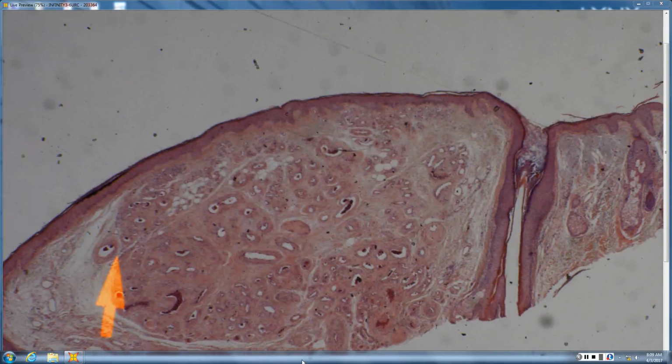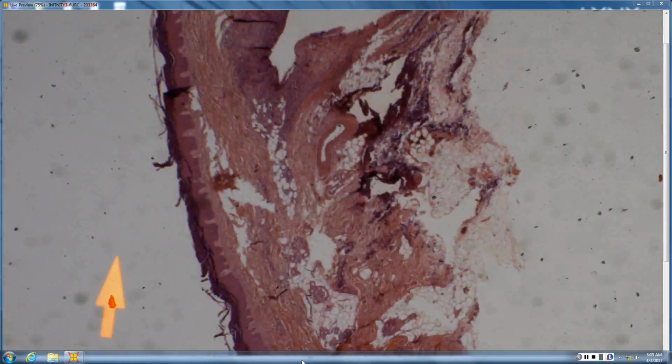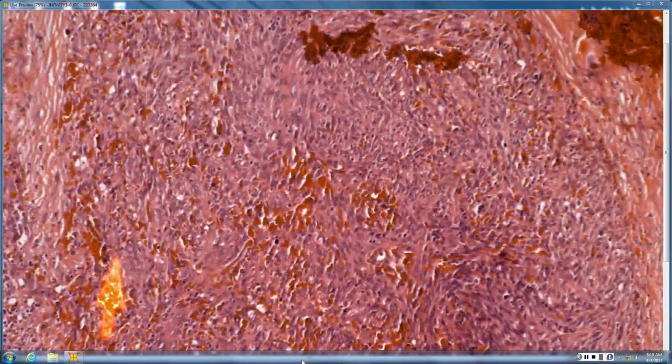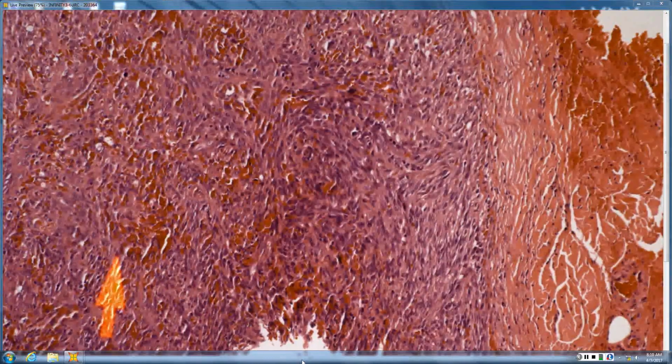So that's sort of the AVM. So thick and thin vessels, so arteriovenous malformation. There's a larger vessel, there are crack-like spaces, hemorrhage, almost looks like a nodular look too. Like a nodular KS. So, definitely spindle cells and erythrocytes in between them, not in obvious vascular spaces.